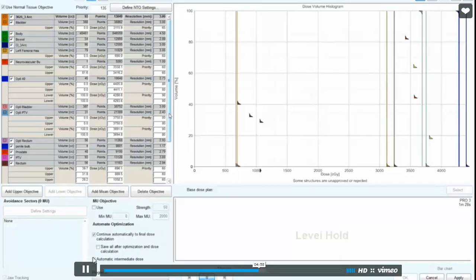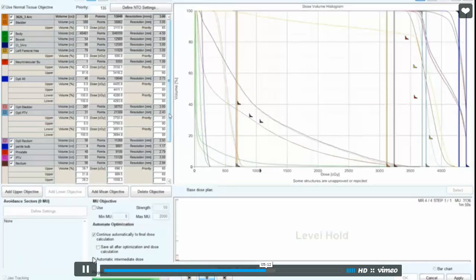So what specific constraints did you bring down to get your better score? The rectum was one I remember. I had a real hard time with the neurovascular bundles. So initially I was really trying to get those down, and then I realized the point value wasn't really that high for it. So that was a rough one. The urethra I just squeaked by and got the ideal goal on there. That was a difficult one for me. I would have liked to get a little bit better conformation number, but 0.93 is pretty good.